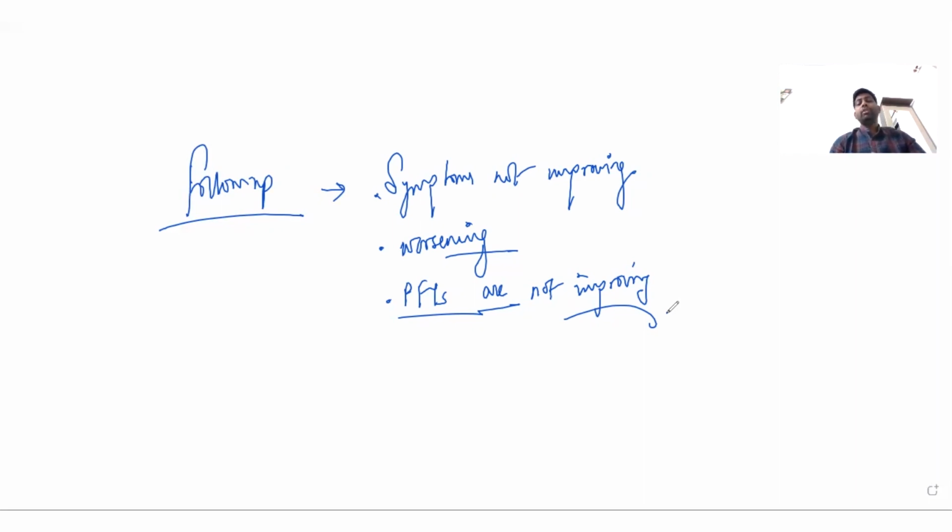So what we saw regarding the indications of CT scan in COVID patients is that there are three basic indications. First, for diagnostic purposes, but not for all. It should not be routinely used for diagnosis. We have already seen the criteria for when it is used for diagnosis. Number two, it is used for management only when a CT scan can change the step of management. And number three, for follow-up of patients of COVID-19. These are the indications.